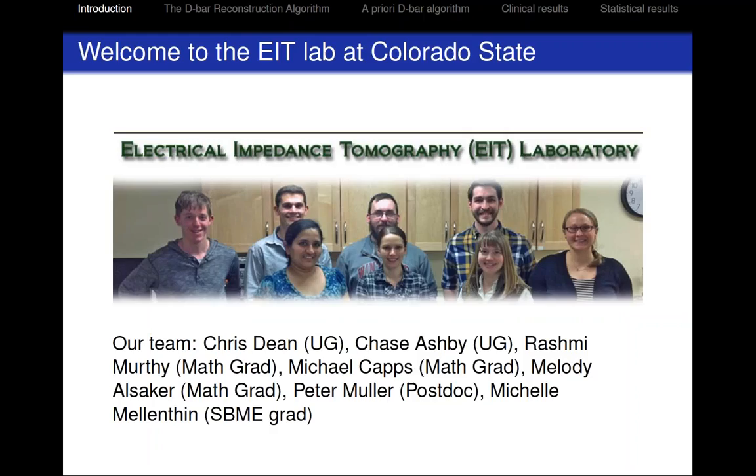So I thought I'd give you this little introduction to the EIT lab at CSU. We have a lab with EIT. Sorry, can I ask a question? Yeah. So there must be disadvantages. I mean, otherwise we would only use that and not the more expensive option. So what are the disadvantages? So the most glaring disadvantage is the lack of spatial resolution. I guess I haven't put up any EIT images here yet, but you will see that they do not compete at all with the spatial resolution of CT scans or MRIs. Okay, thank you. Yeah, that's the big one. However, they do have their niche.